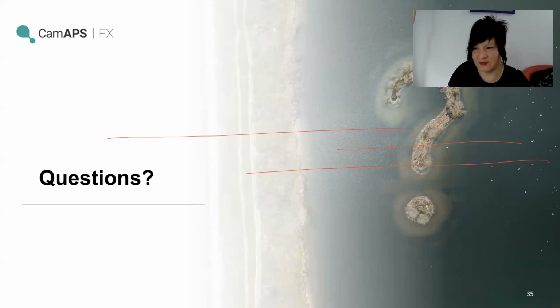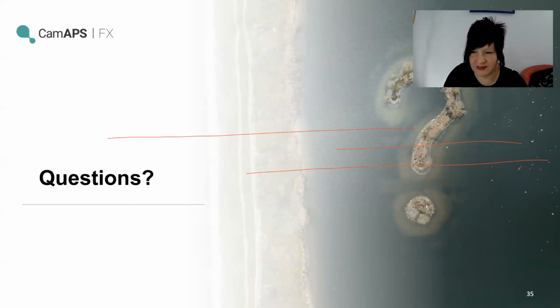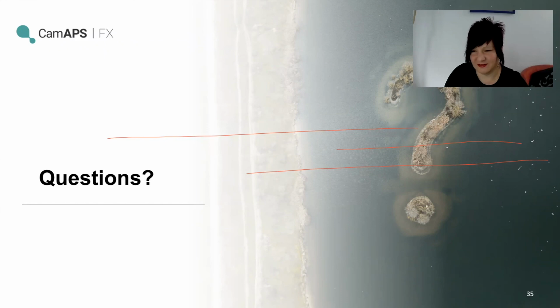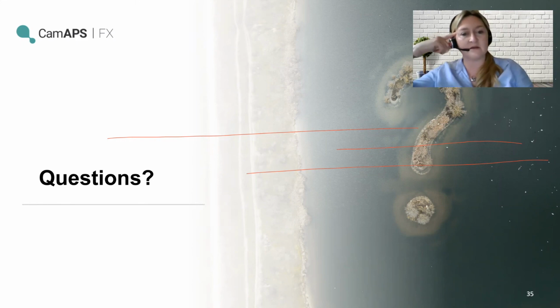54 was my most recent one. Yeah, but that dropped quite dramatically in spite of taking it even slowly. Being careful, it came down quite quickly, but that was kind of the best we could do. But dramatic effects. So I think sometimes, doesn't matter who you are or what's going on, not necessarily complications or anything, if you're getting a lot of ups and downs and that sort of sawtooth effect, sometimes just push the target up, even just for a few days, just till it all settles down a bit, and then you can nudge it back down gradually, and that can make a huge difference.